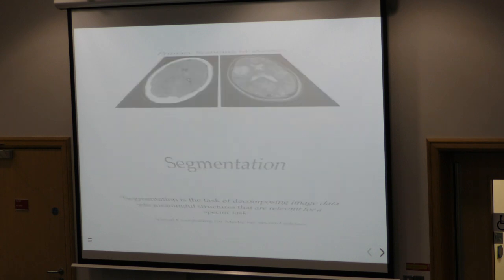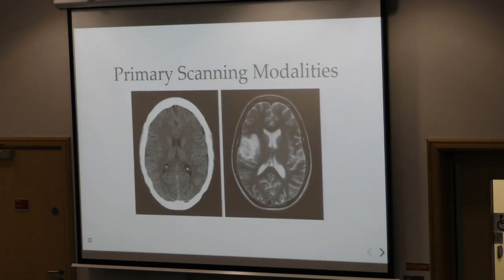Just in case it wasn't entirely clear from this image, these are cross-sectional cuts of a section of a patient's body. So they're 2D.